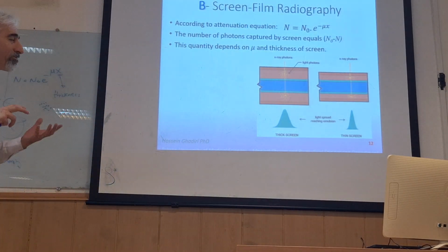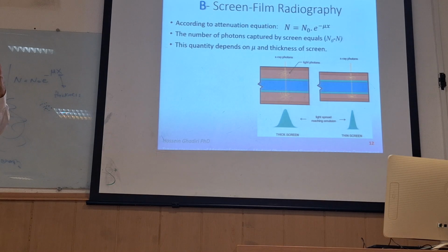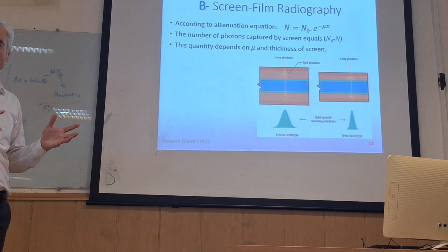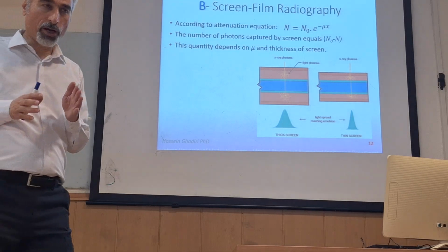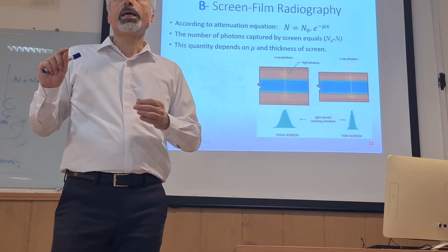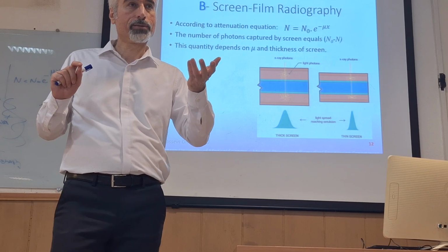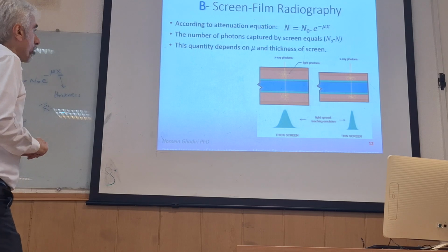This is because we have different types of screens in different machines. We have the same reasoning in the digital detector. For example, in mammography, we need a high resolution digital detector. In radiography, we need a high absorption digital detector, and it depends on the machine.